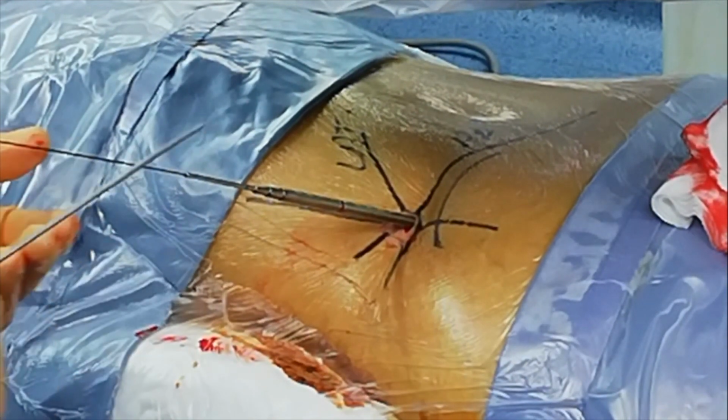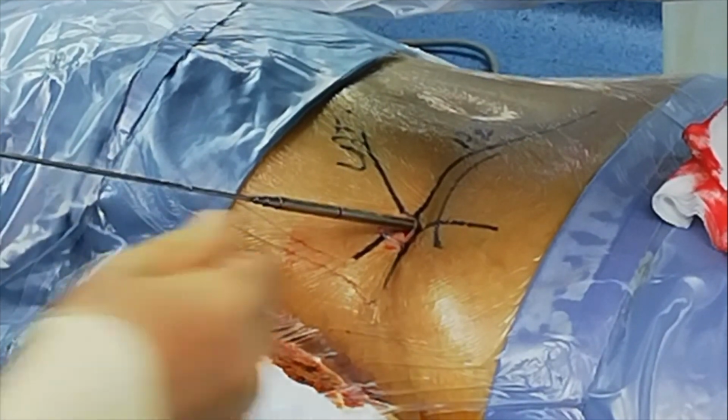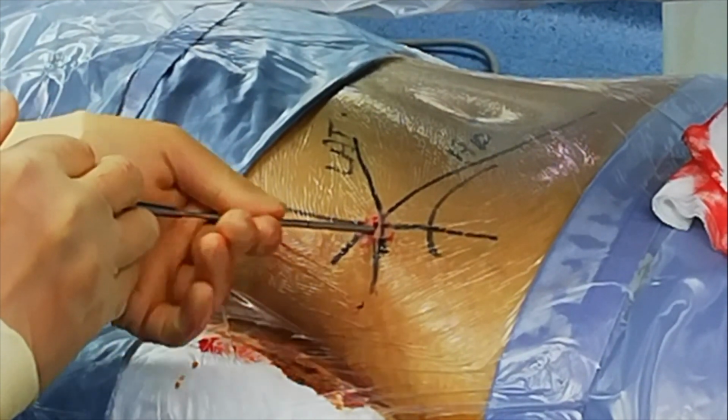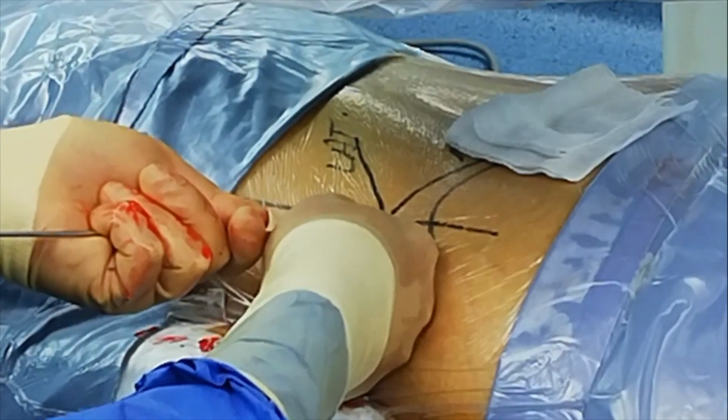And then this is the stopping rod. So we always use that just to keep the first rod in place as I remove the yellow and the red sleeves. Thank you. Swap.